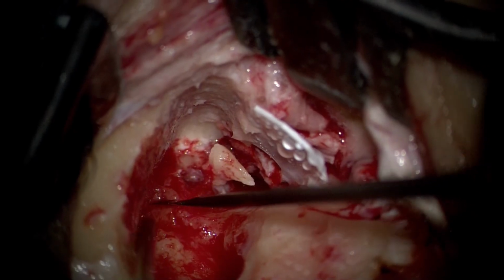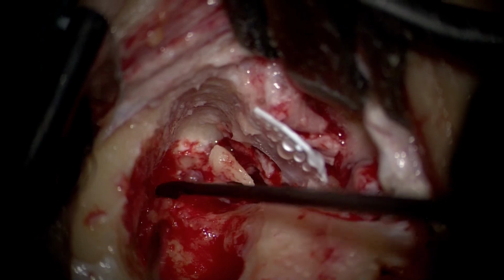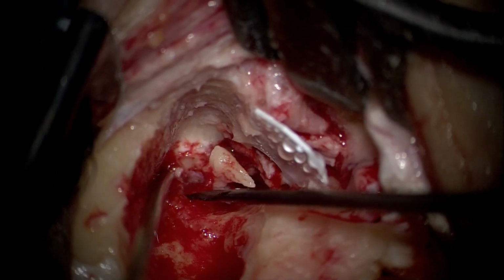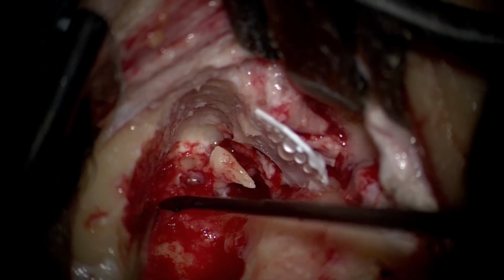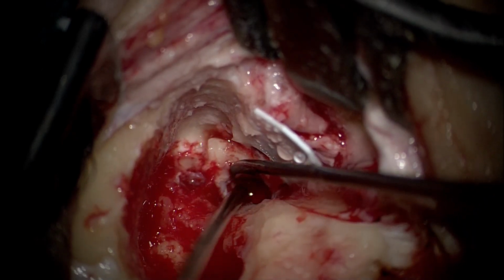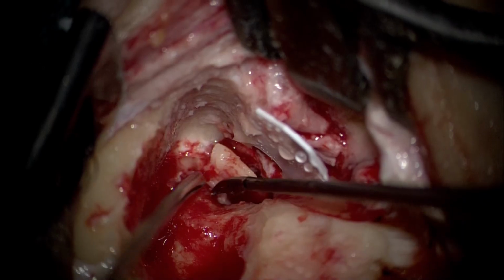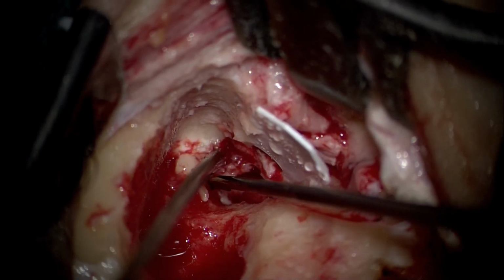So once the tegmen plate has been cleared, now we are clearing this diseased mucosa or granulations at the level of the lateral canal. Now, as you can see, since this patient has had a severe hearing loss, hearing right now is not of much concern here. It's already a non-serviceable ear with the opposite ear being totally disease-free. So we can take our liberty in disease clearance in such patients without worrying too much about the hearing.